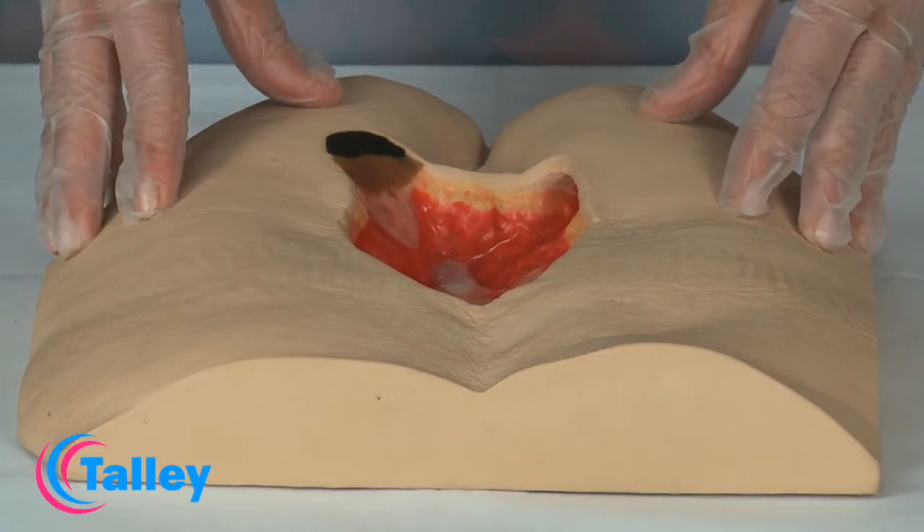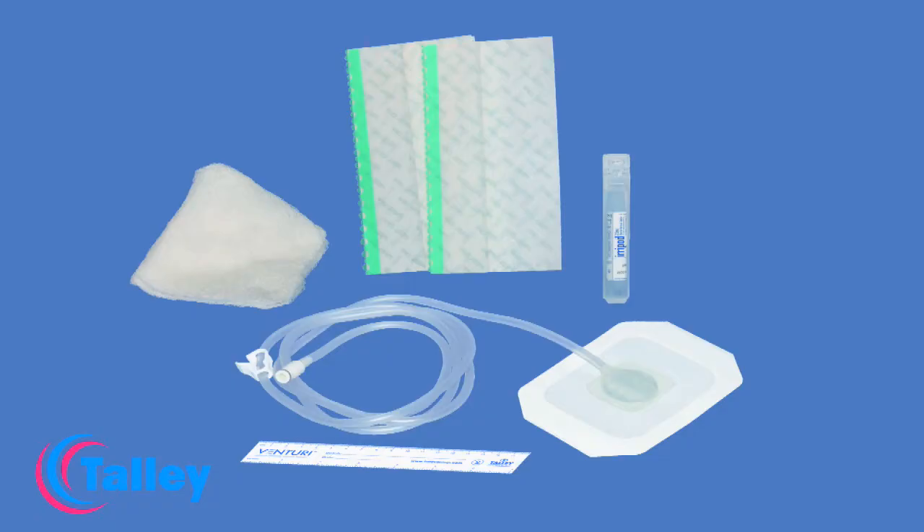The wound is now ready for the wound care set to be applied. The Venturi portal drain and gauze wound care set comprises a portal drain, antimicrobial gauze, transparent film wound dressing, saline, and a measuring tape.